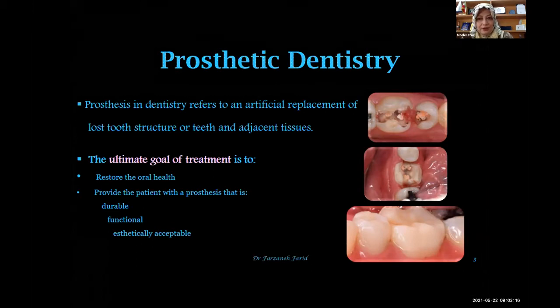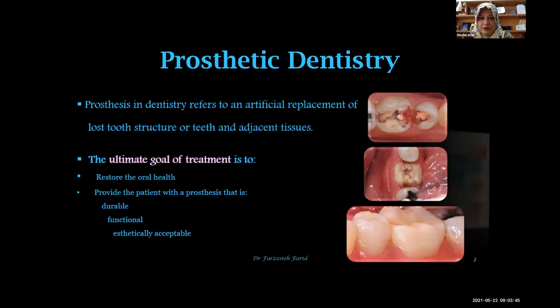The digital technology can help us in many ways. One of them is in the laboratory procedures. It makes the laboratory procedures faster and with fewer steps. And the results, as I saw, have fewer complications. However, the CAD/CAM or digital laboratory procedures are not the only use of digital technology.